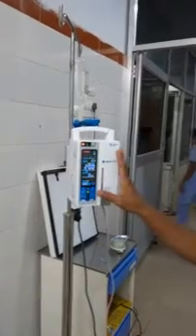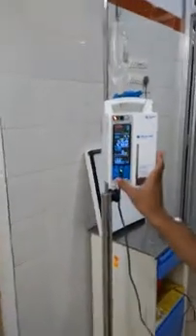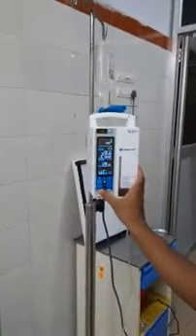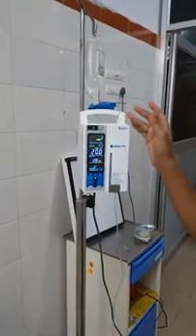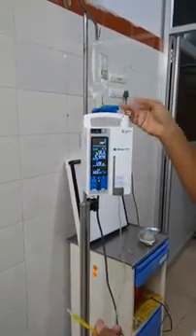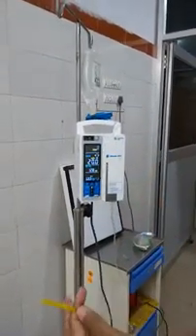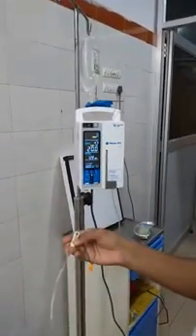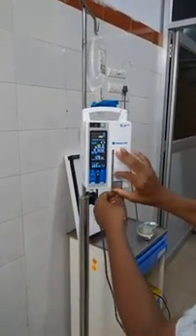So here we are seeing an air bubble alarm or air in line alarm. This is a very irritating issue in cases of infusion pump, in which we can see that we have got an air here. So we have to correct the issue. First of all, I have closed this roller clamp now, and then I will open the door.